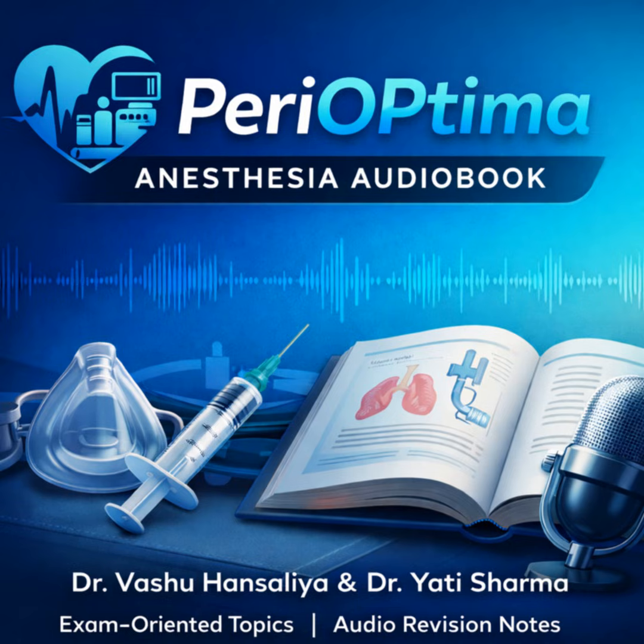It's the only way to catch it. Is there a second, more subtle failure mode we should know? Well, yes. They also don't fully protect against cylinder exhaustion if the O2 pressure stays just above that critical threshold, say at 40 psi, but the actual volume is very low. Because it's a pressure sensor, not a volume sensor.